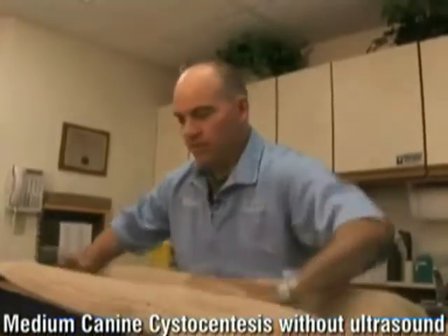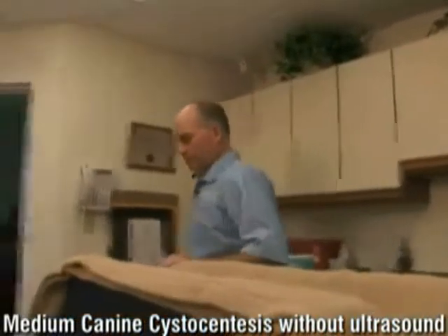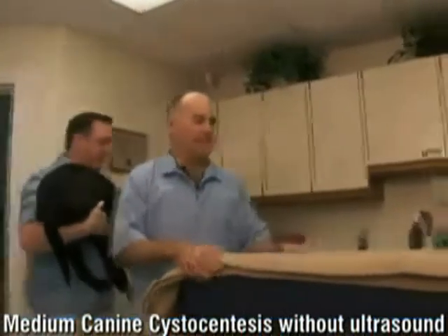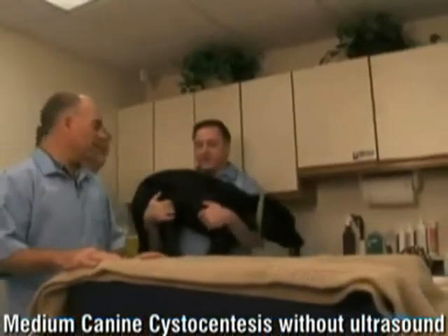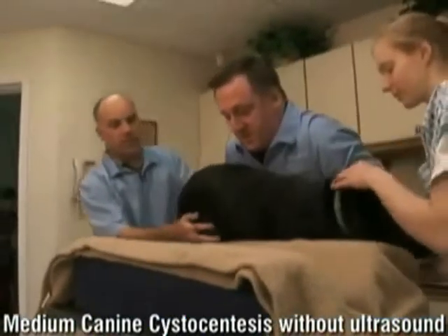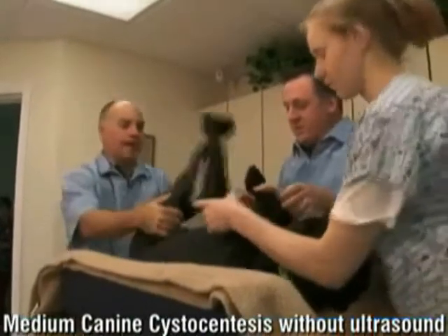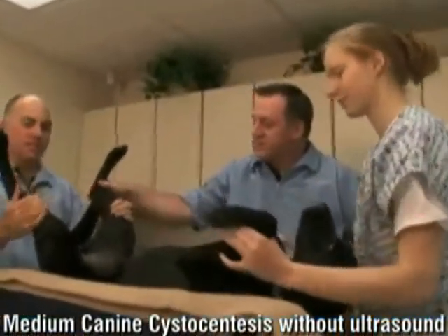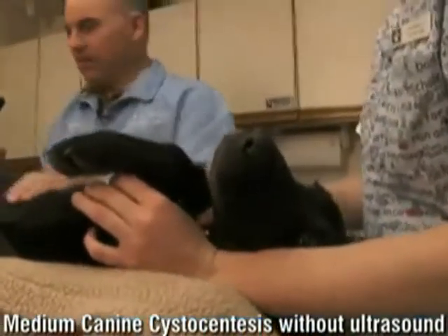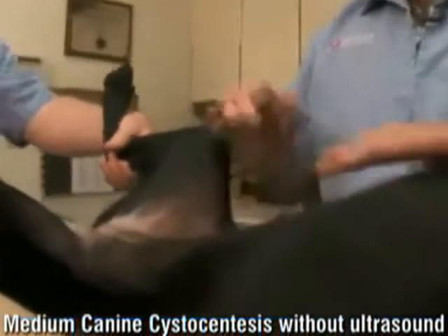So now we're going to do urine collection on a female with no ultrasound — a medium sized dog, about a 60-pound lab. If we're going to put dogs on their backs, which can be uncomfortable, we like to use this little couch — a small ultrasound couch — but you can use it even if you don't have ultrasound. Just kind of take a nice soft blanket so there's a nice little cushion and it's reasonably comfortable. This is my pride and joy — this is my own dog, Zildjian, my lab. So she better be good.